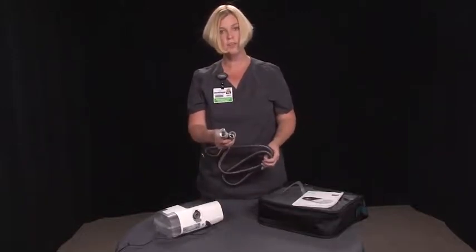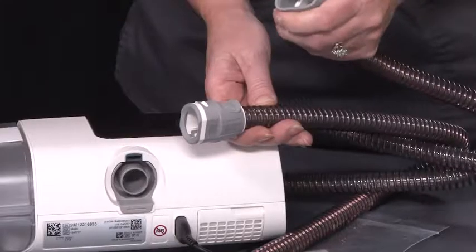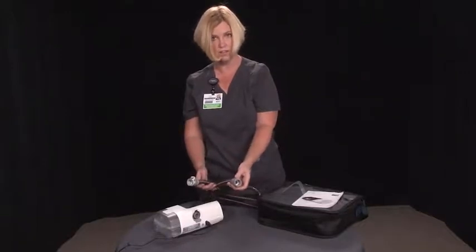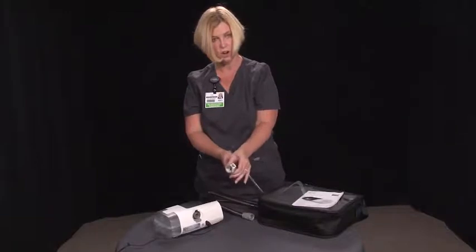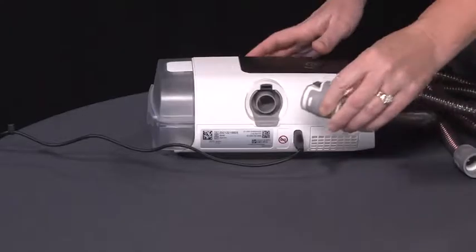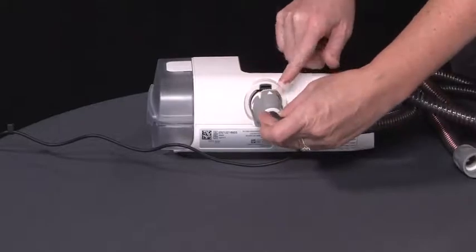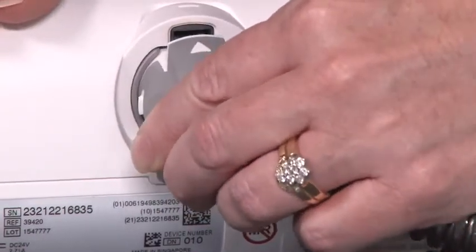This is your tubing connector. There's two ends. One is soft and flexible, and this end is for your mask to connect to. This end is hard and not pliable. It has a chip right at the top, and you line this chip. There's an arrow here and an arrow here, and you line it up and press straight in.